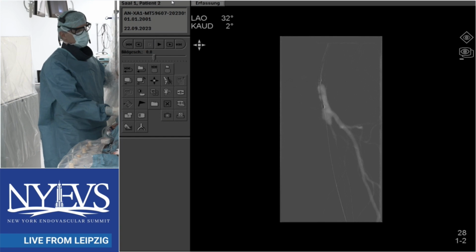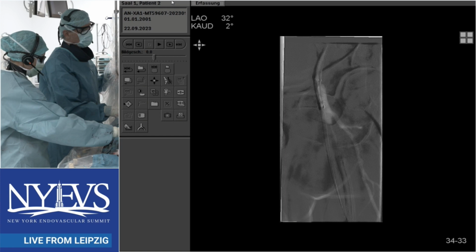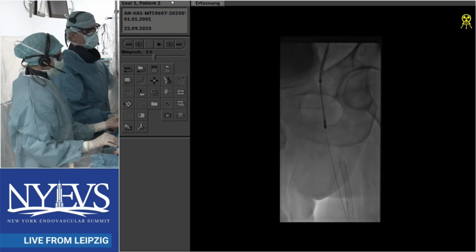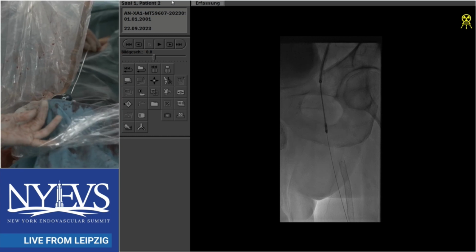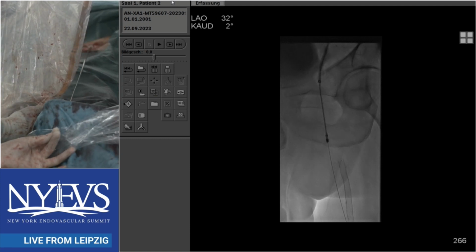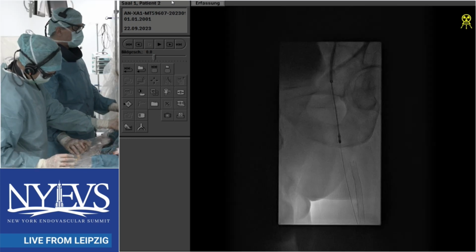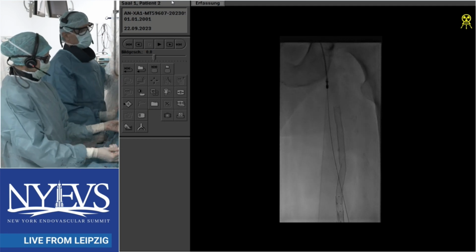Yeah, with prosthetic grafts, actually, we never have problems with ripping a hole. And of course, it's different with vein grafts. But it helps, in fact, if you go in, certainly you have to observe whether some blood is going into the bag. If not, that means the arterial wall is really sucked to the head of the catheter. So you have to stop. And then you see blood going down again. And then you continue. So you have to use this kind of stepwise treatment.